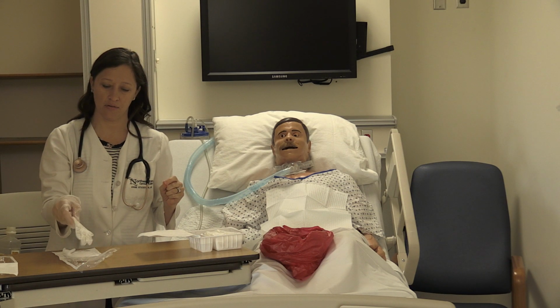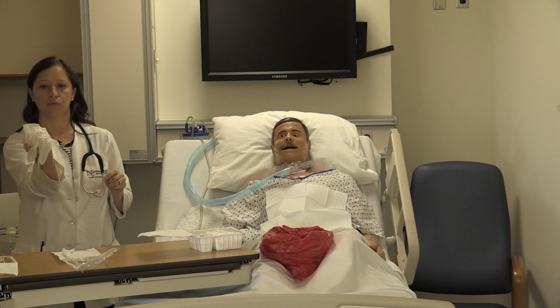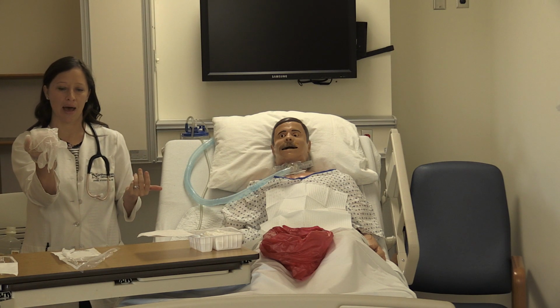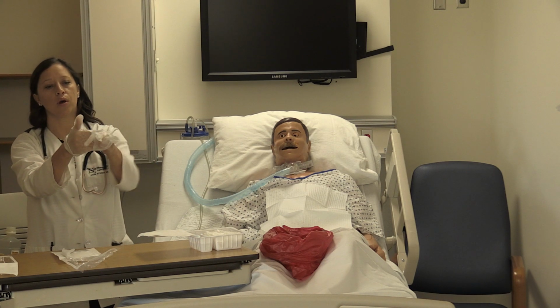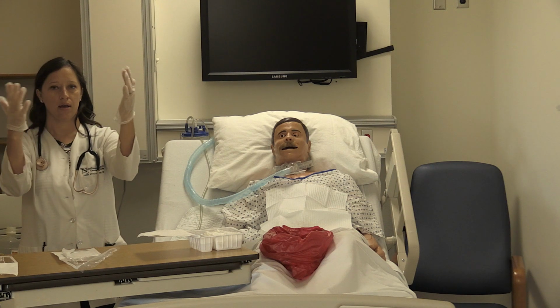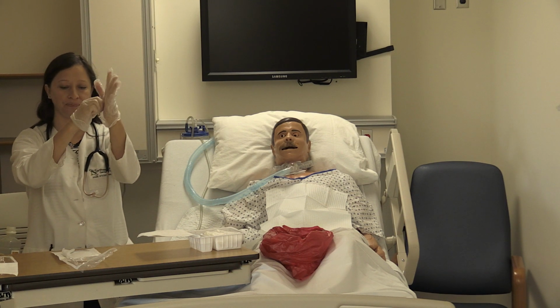These are always kind of just in here, folded up kind of in a bundle, so you kind of have to squiggle around and get it situated. So you want to pick it up and then step back so that you don't contaminate anything of your sterile field. Then you want to put your other glove on, and now you are sterile and ready to start the procedure.